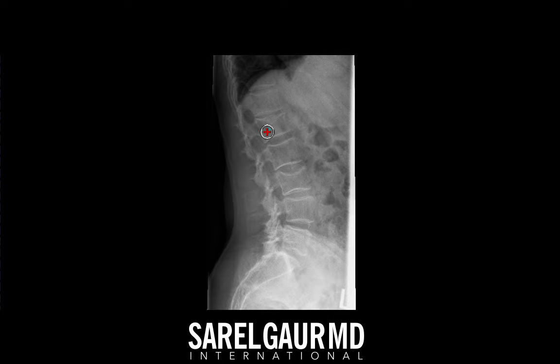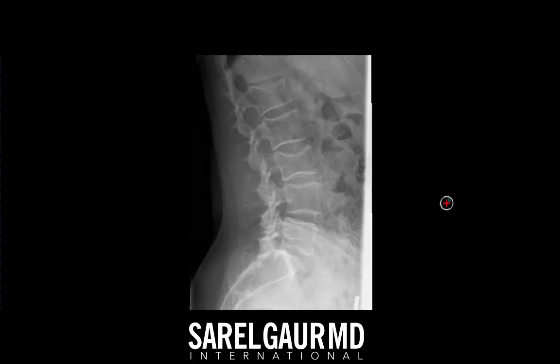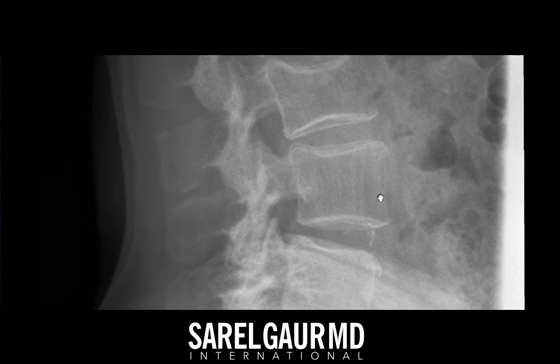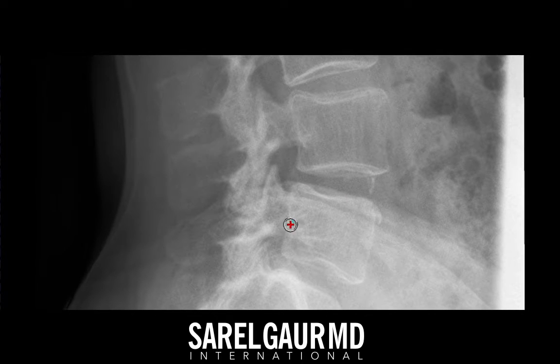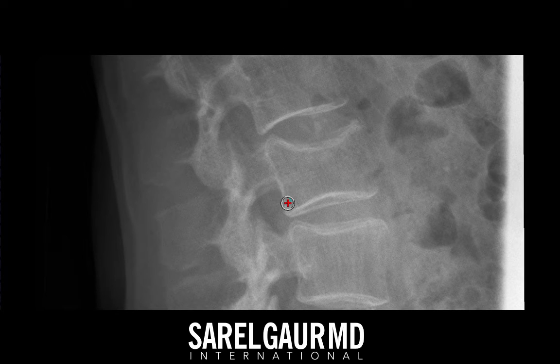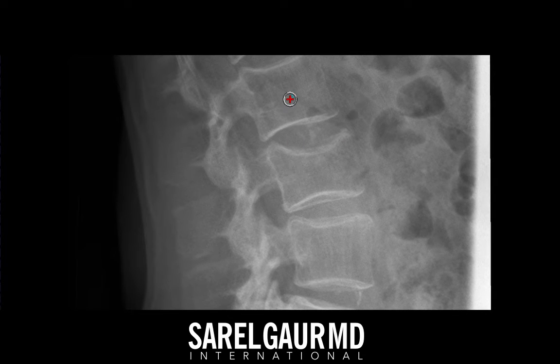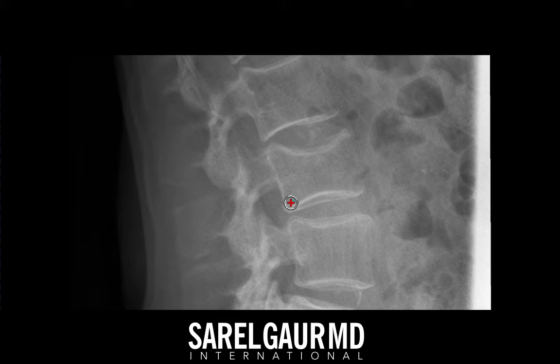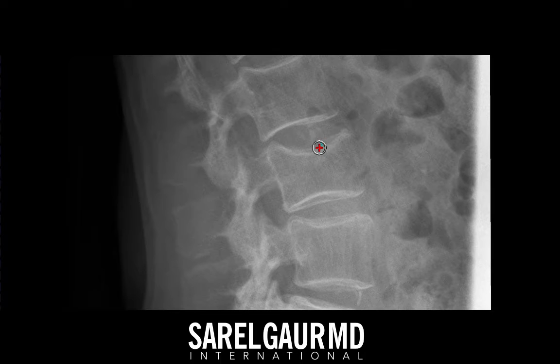Here's a patient that presented status post mechanical fall. What I always do when looking at the vertebral body is zoom in and take advantage of the spatial resolution, scrutinizing each level looking for height loss. As I come to the L3 level, I'm noticing loss of height of this vertebral body. Comparing L3 to L2 above and L4 below, there's definitely asymmetry and loss of height. There is depression of the superior end plate, so this finding is suspicious for acute fracture.